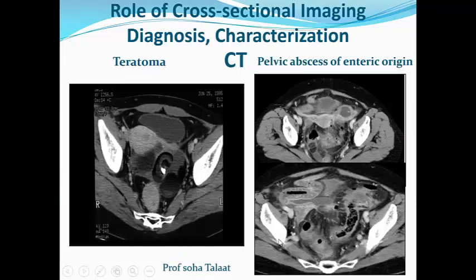So what is the role of CT? We are talking about the cross-sectional imaging. What is the role of CT? CT is not the modality of choice in adnexal lesions, except in teratoma.